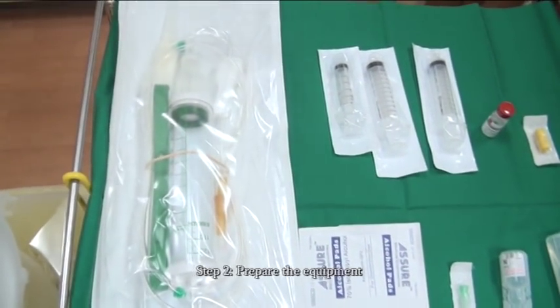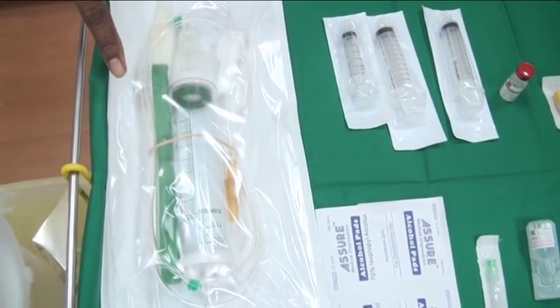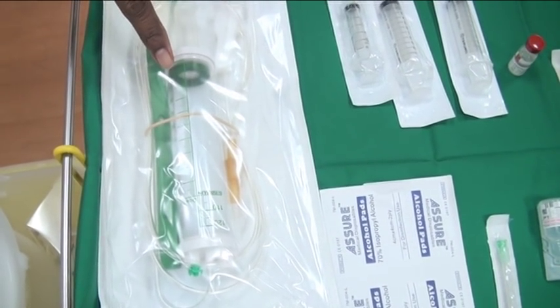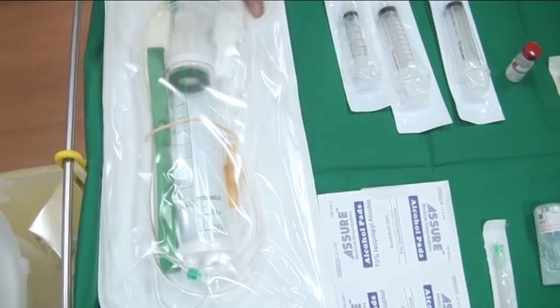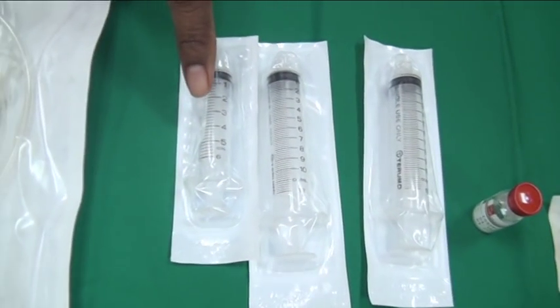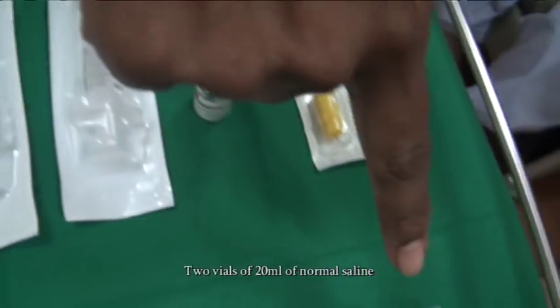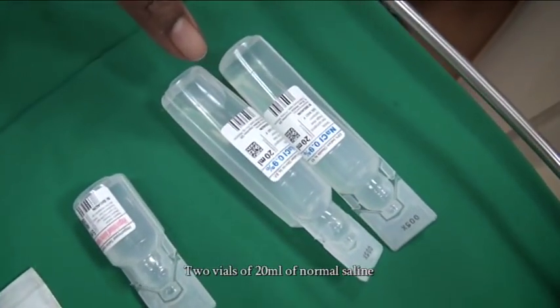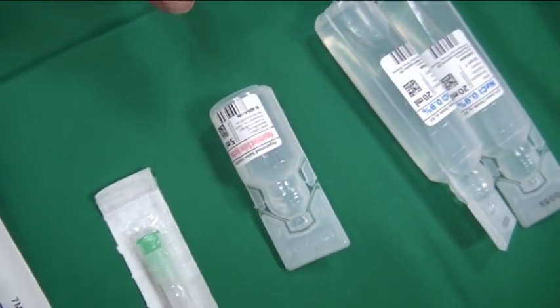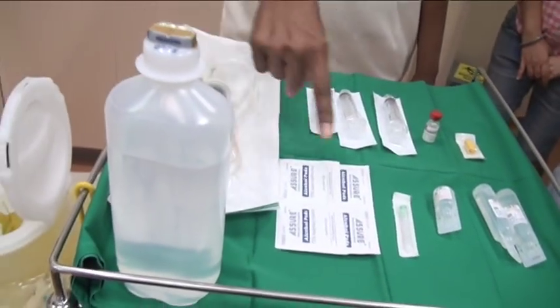Step 2: Prepare the equipment. For this you will need 1 burette, two 10ml syringes, 1 five ml syringe, 2 vials of 20ml of normal saline, 1 vial of 5ml of heparinized saline, 1 pint of normal saline, and 1 needle.